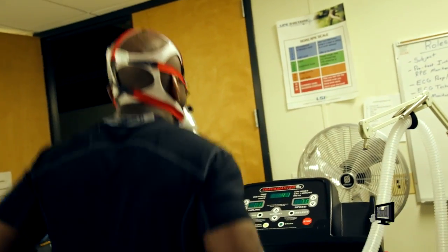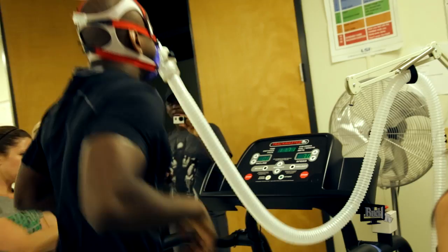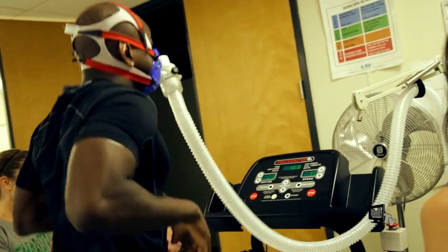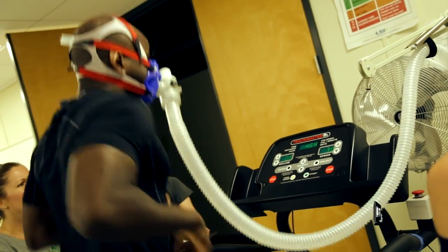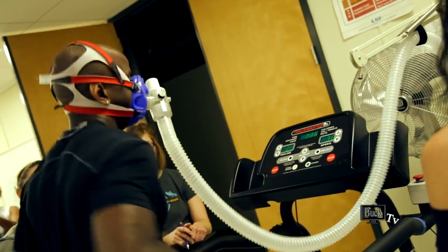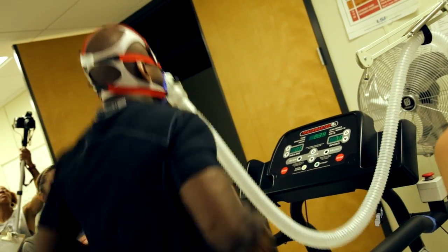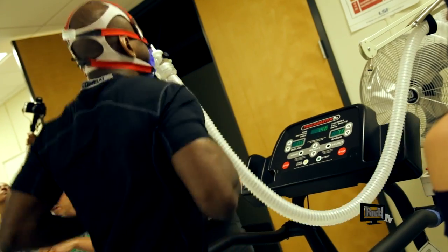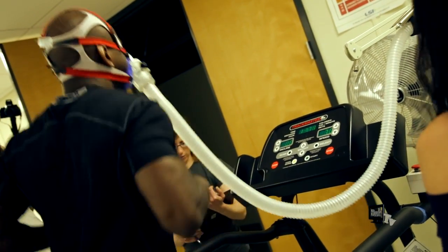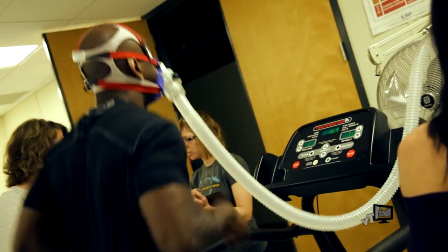You want to be backup heart rate? That Polar sensor is connected to the computer, so it's automatically recording his heart rate. But in the event that it stops working, what do you have over there? 168. 171. You feel okay? Just relax, like you're out running in the park on a beautiful day. In case Valerie says her heart rate's not picking up, you can record it.